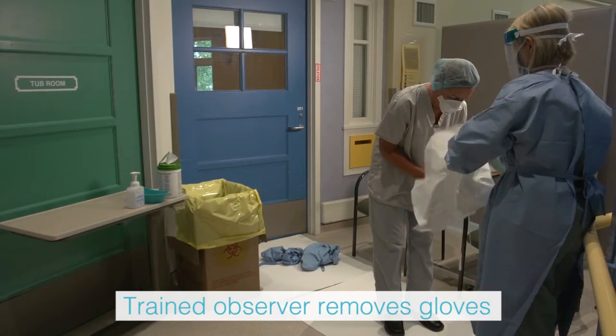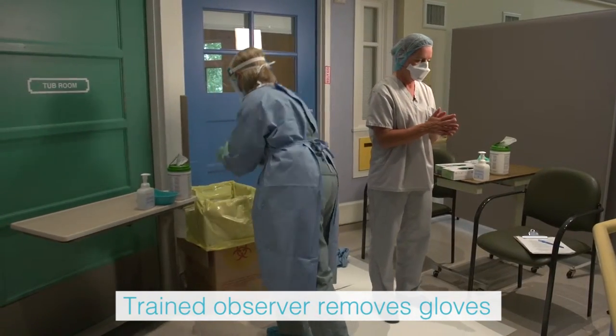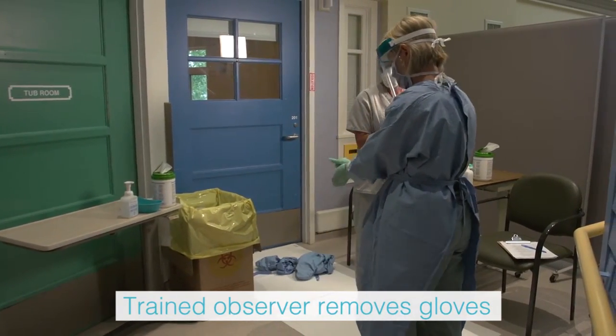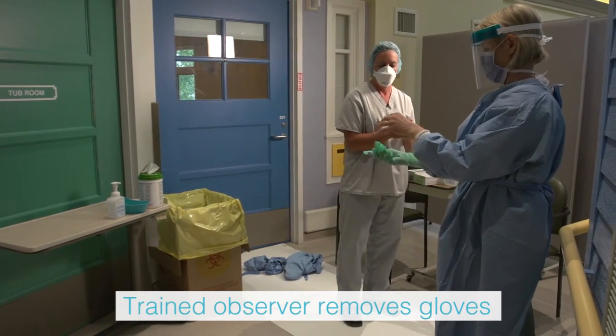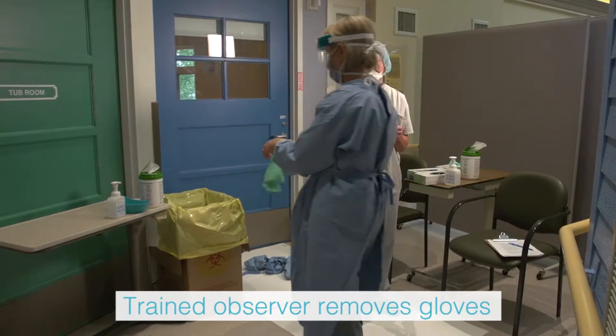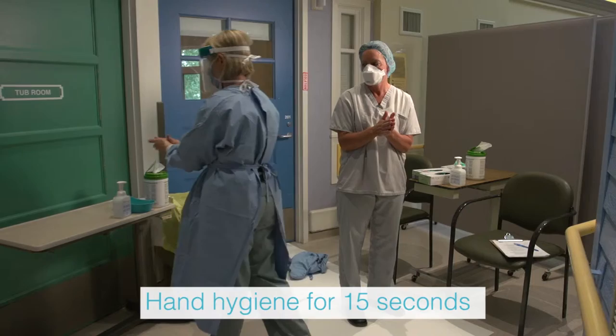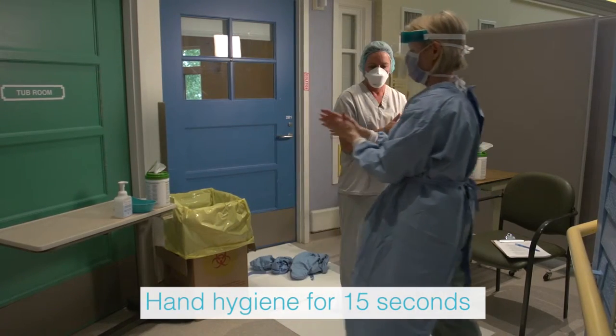The trained observer removes the inner glove by grasping the outside edge near the wrist and peeling away, rolling the glove inside out. Slide one or two fingers under the wrist of the remaining glove and peel away. Discard immediately into the waste receptacle. Perform hand hygiene using alcohol-based hand rub and allow hands to dry completely.